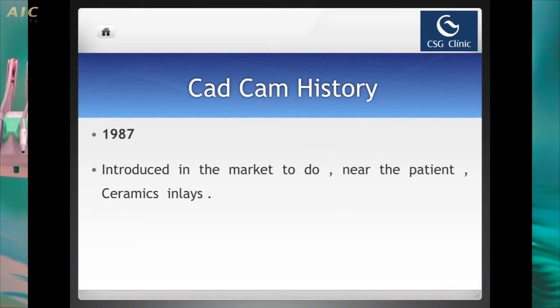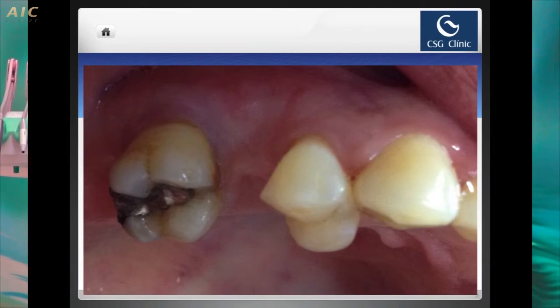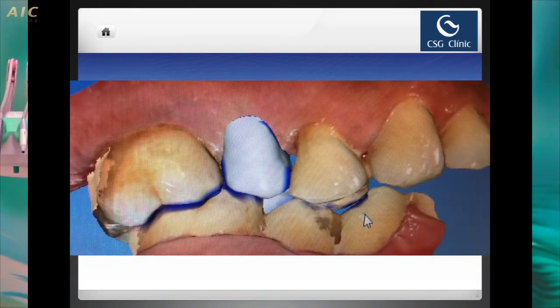So, in my office, what I do, and I really like to work with CAD/CAM, is, for example, do virtual wax-ups. It's very good to explain this to you before we see the black dot, etc. But the best thing for me is that we can predict where I'm going to place my implant, and it's more predictable as well. So here you can see where I planned my implant, and then I drill it, and after raising the flap, I put my implant in the same place.